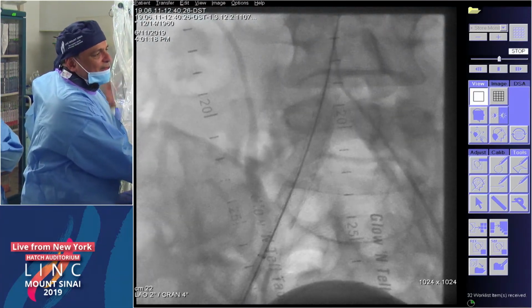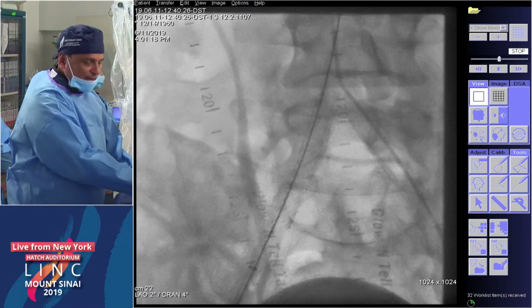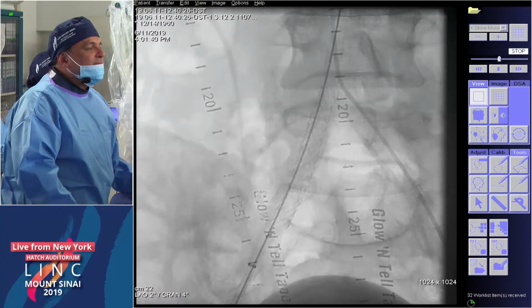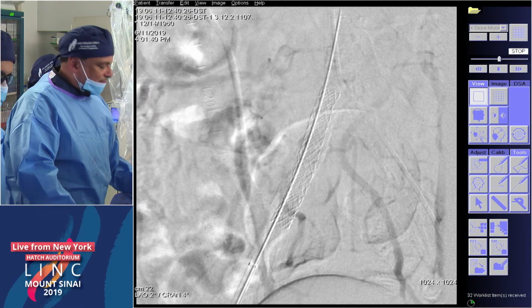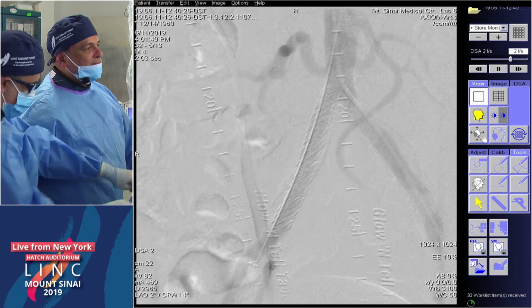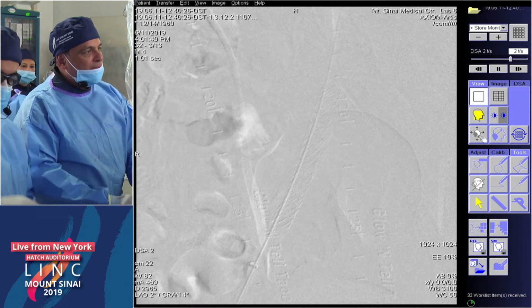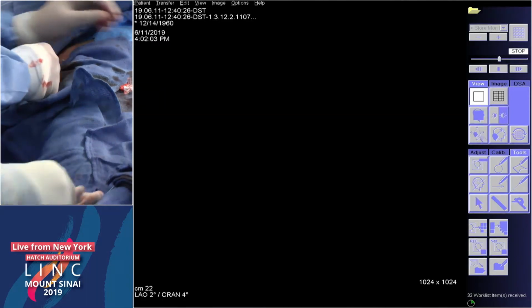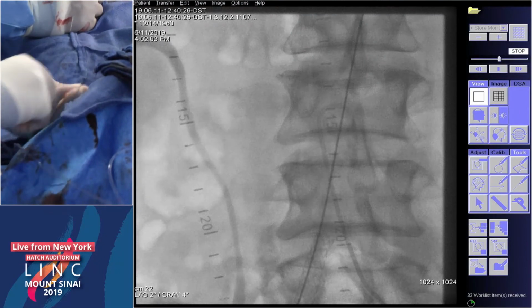I think the key here, Jim, and I think for Anwar, you would totally agree with me, is that hypogastric. I have a question for you. Say you have the same patient with occluded hypogastrics. Would you still fix the common iliacs? With occluded hypogastric, yeah, because he's still claudicating, and your profunda is going to supply blood flow to the pelvis as well as your IMA. So I definitely would open him back up and count on retrograde flow from the profunda as well as antegrade from the IMA. So my question to you is, would he have as profound a relief of symptoms as he's going to have now? Your guess is as good as ours.